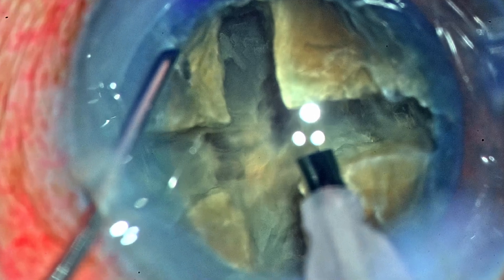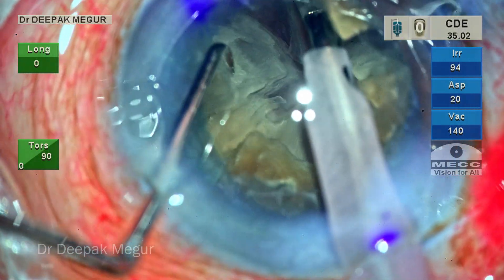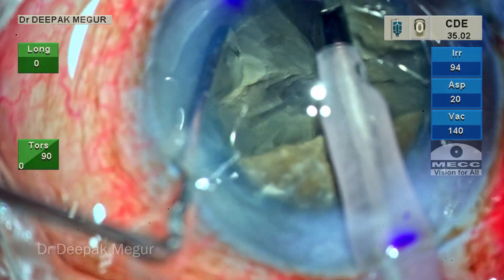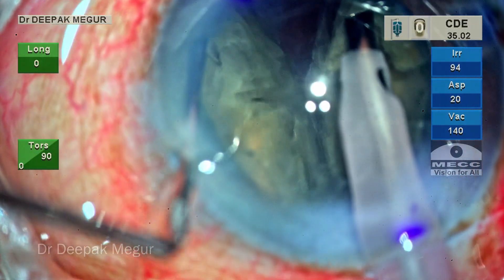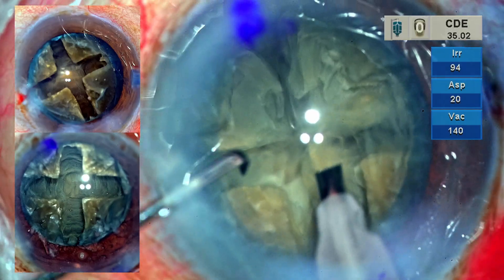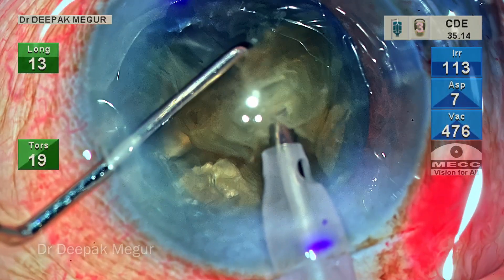This would be the time to stop and attempt cracking. As I feel that all grooves have reached equal depth, now is the time for lateral separation. The chopper and the tip are both kept deep into the groove and the lateral separation maneuver is performed. Because the posterior plate has been so much thinned down, the lateral separation is very easy and we can fracture the nucleus into four fragments quite effortlessly.